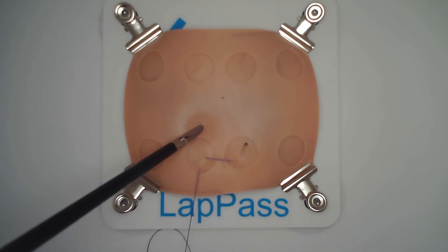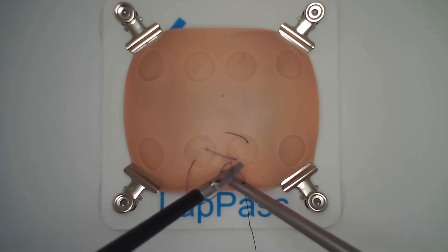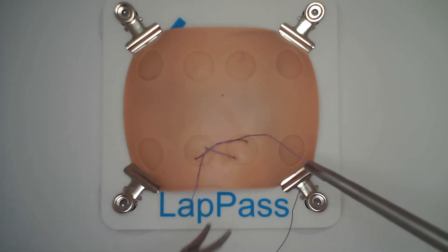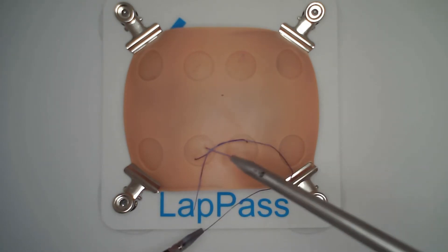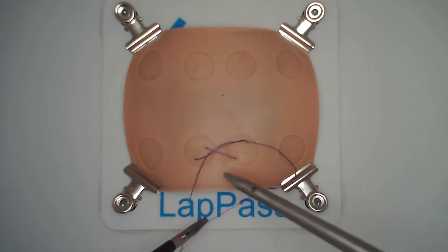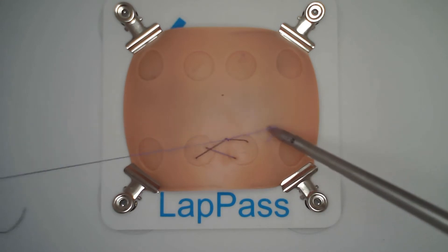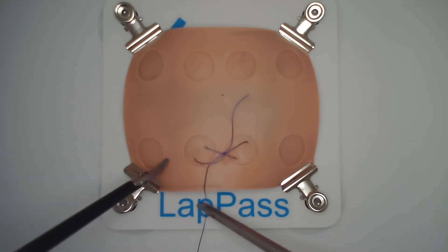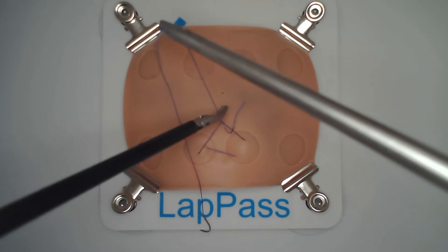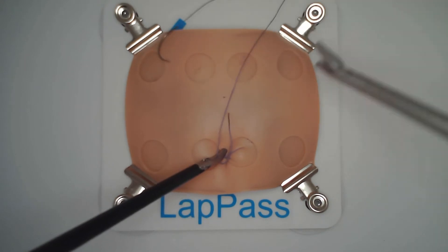Key points here: make sure the knots are square and well placed. Here we're demonstrating a Zabo knot. The first throw is level, followed by a second throw in the opposite direction — in the Zabo this creates a reef knot. The benefit of the Zabo is that it can be unlocked and brought down under a degree of tension and then relocked once the position is found.